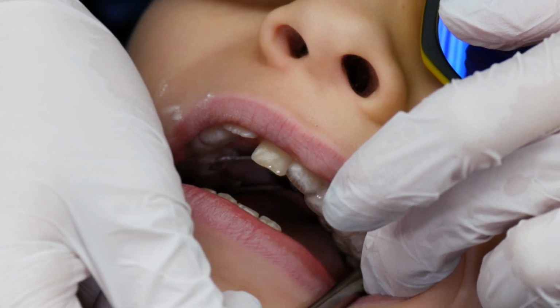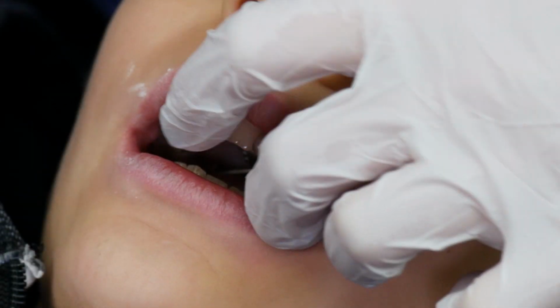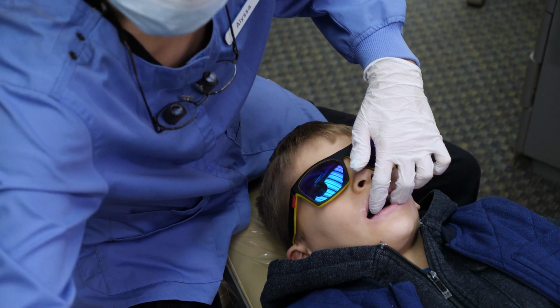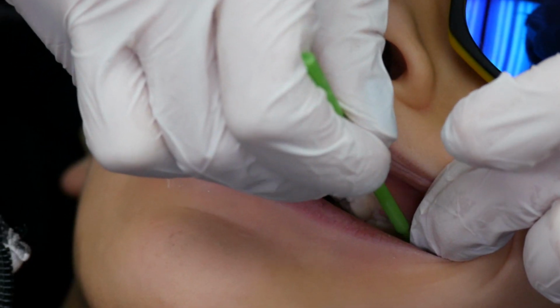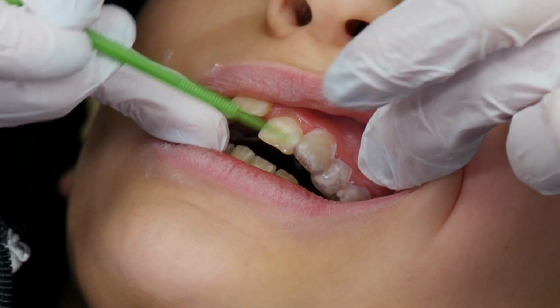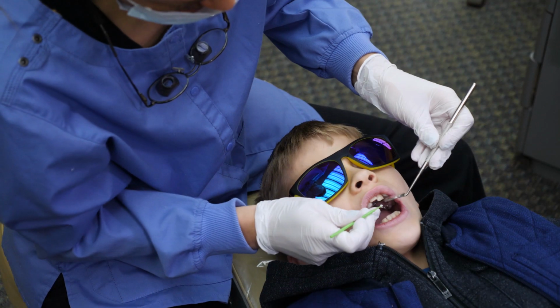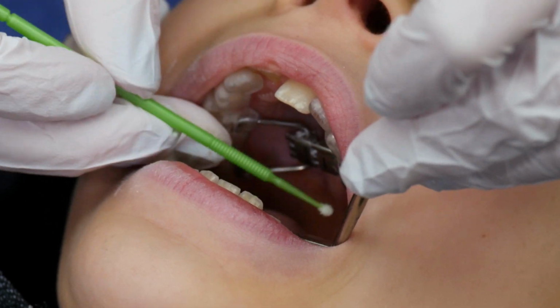There is no etching prior to placement of the expander, as well as no drying of the teeth necessary. Immediately after placing the DeLuke contoured expander onto the patient's teeth, assistants should use a micro sponge applicator to clean excess adhesive at the gum line after fully seating.